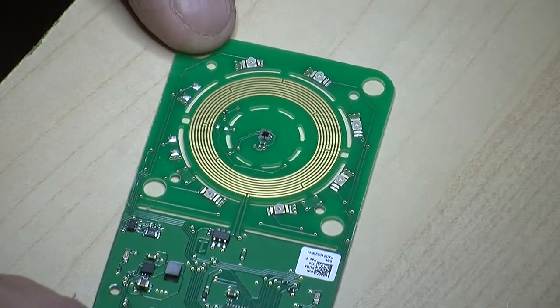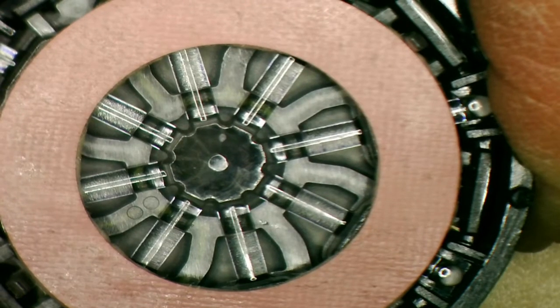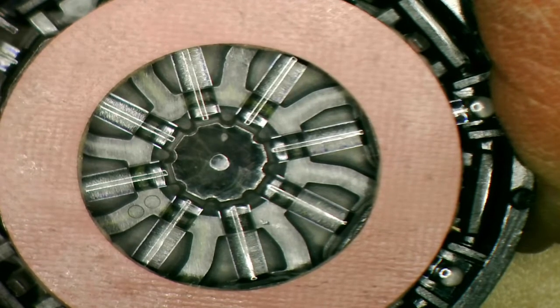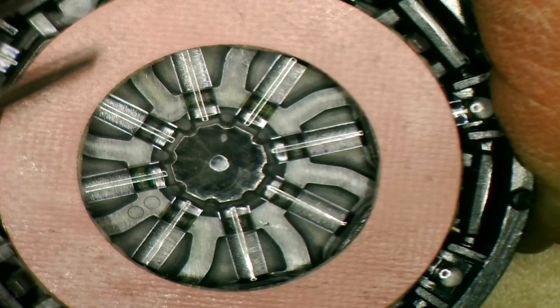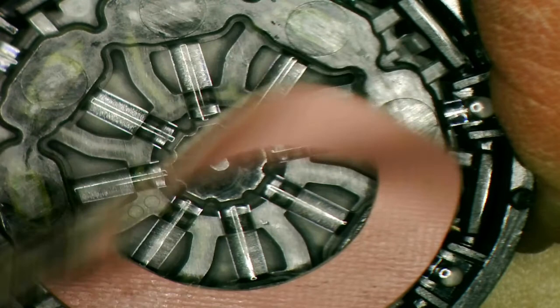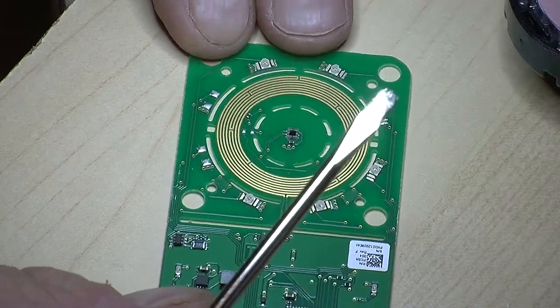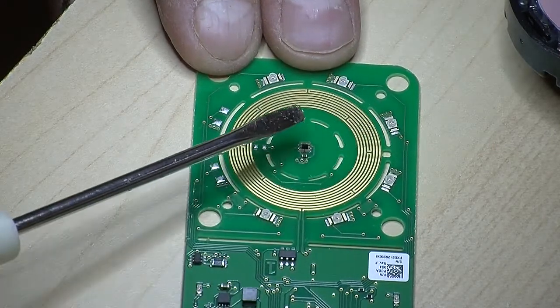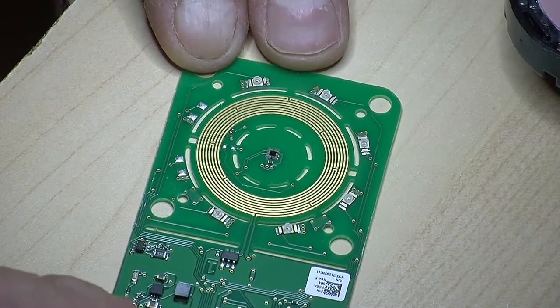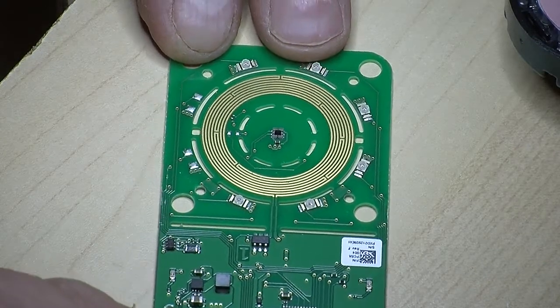And it looks to me like the pink stuff in the module is in fact some sort of a resistive material that can get nice and hot. I am wrong. It's not a resistive material. I'll tell you what it is. So this long, very thin piece of circuit board plating that is gold plated, it looks like, is in fact the heater itself.